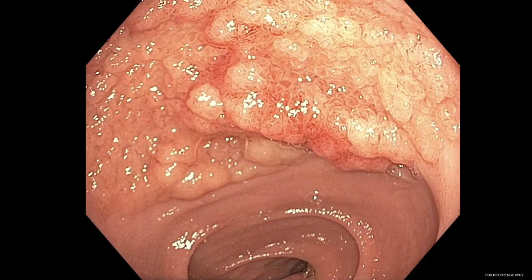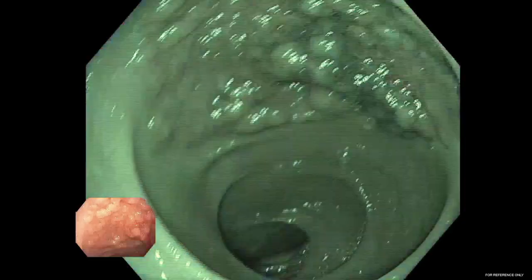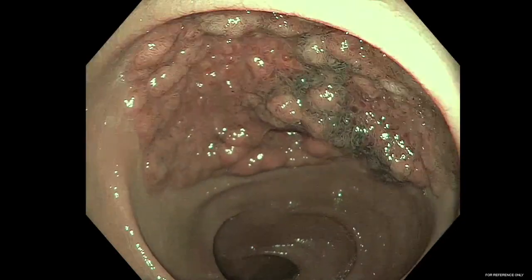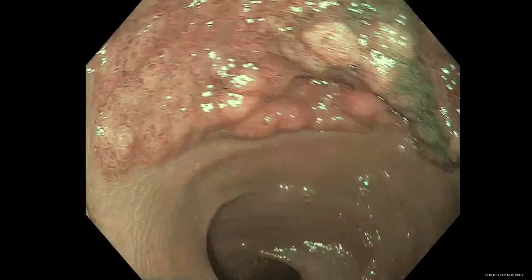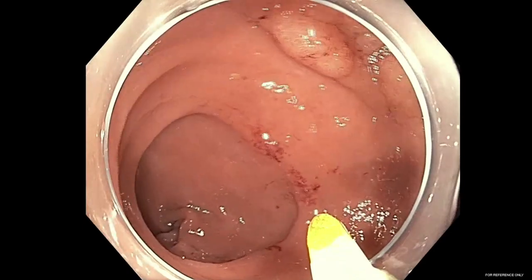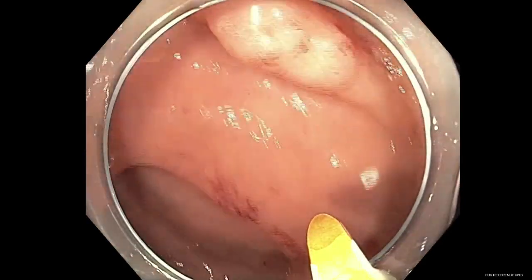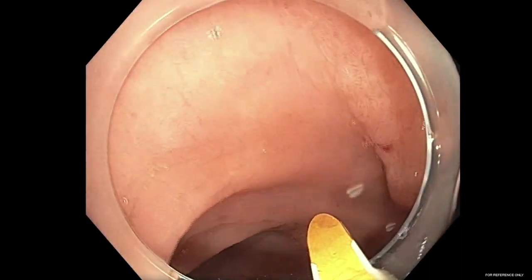In this video, we first demonstrate a 60-millimeter non-bleeding, carpet-like LSTG rectal lesion found approximately 3 centimeters from the anal verge. Image-enhanced endoscopy with narrowband imaging, or NBI, as shown here, illustrates a type 2 non-invasive pattern for the NICE classification.